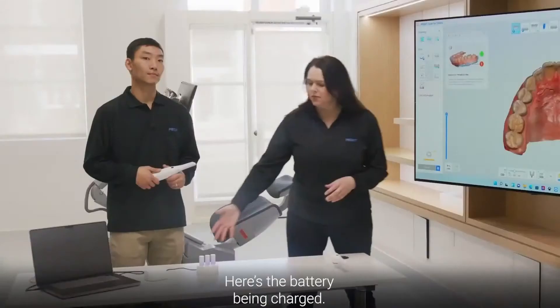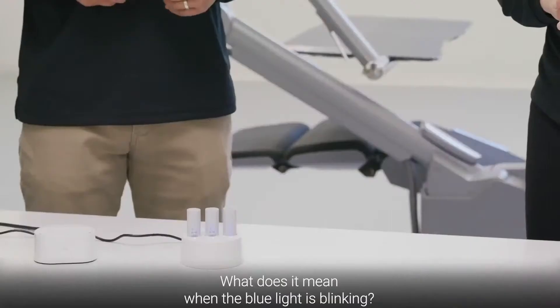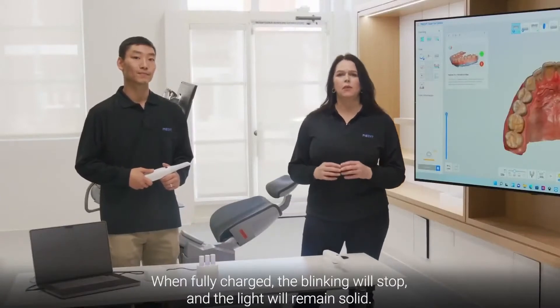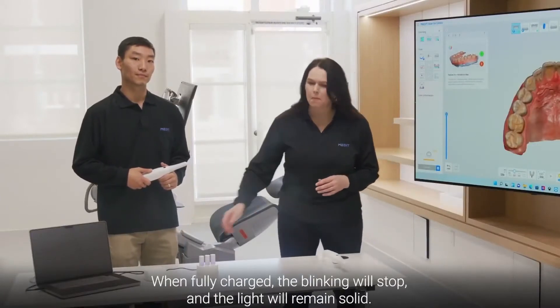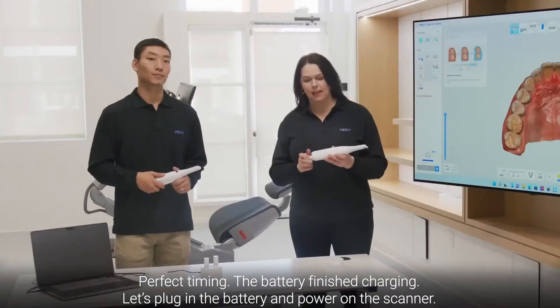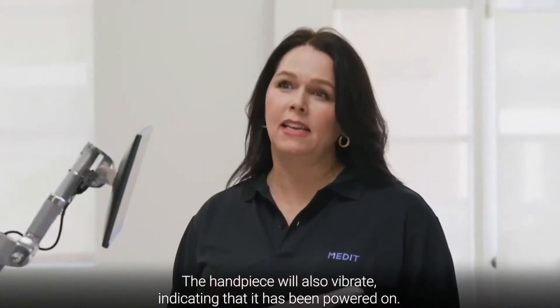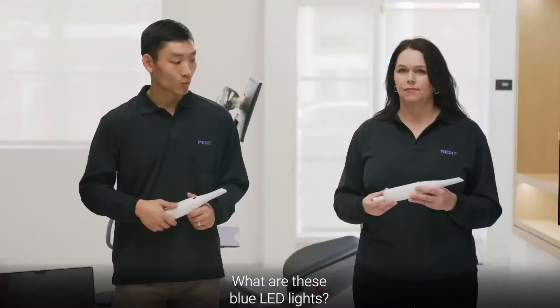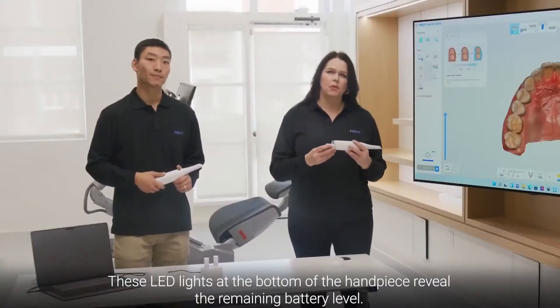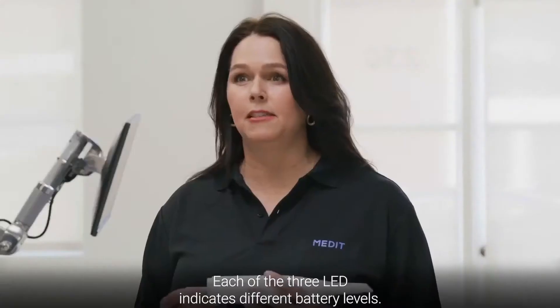Now let's set up the battery. The blue light blinking means the battery is charging. When fully charged, the blinking will stop and the light will remain solid. The battery just finished charging — let's plug it in and power on the scanner. The handpiece will vibrate, indicating it has been powered on. The blue LED lights on the bottom of the handpiece reveal the remaining battery level, with each of the three LEDs indicating different battery levels.